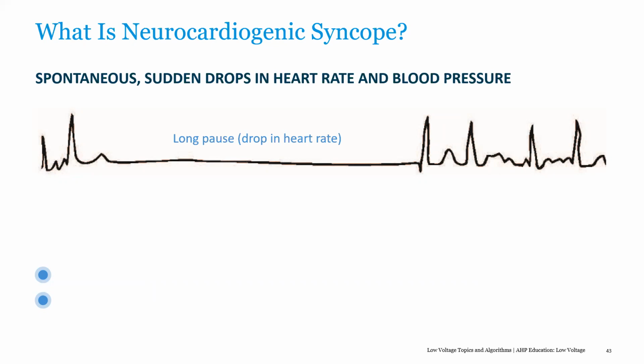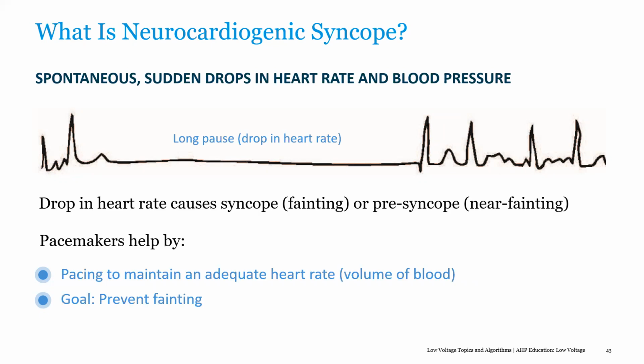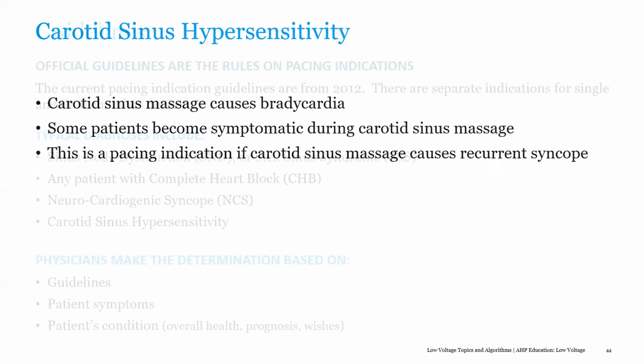Long pause and drop in heart rate. Drop in heart rate causes syncope, fainting, or pre-syncope. Pacemakers help. They prevent it, they only kick in when the patient needs it. Prevents fainting. I'm not going to get into carotid hypersensitivity. That's a little too much.